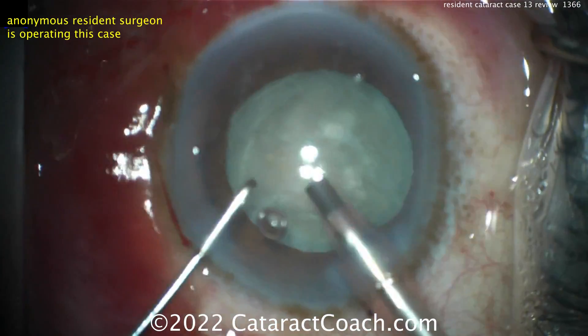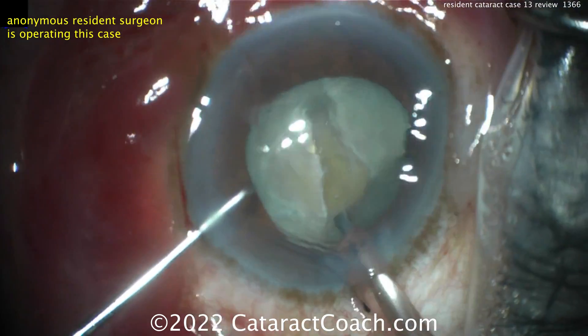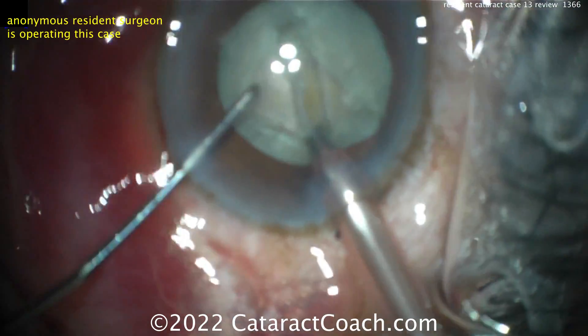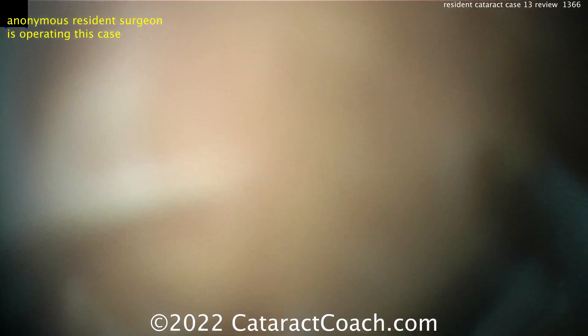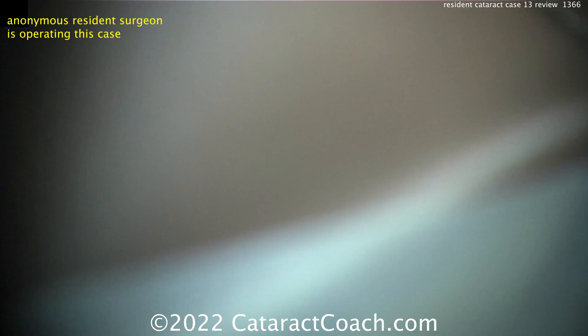Now for the phaco part — phaco probe going in, here comes the chopper. We're going to do a groove down the middle. The grooves are pretty good, the eye's pretty much staying in primary. Now the patient's really dancing around a lot — lots of motion, lots of movement from the patient.